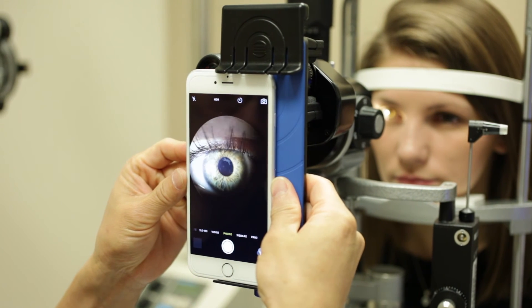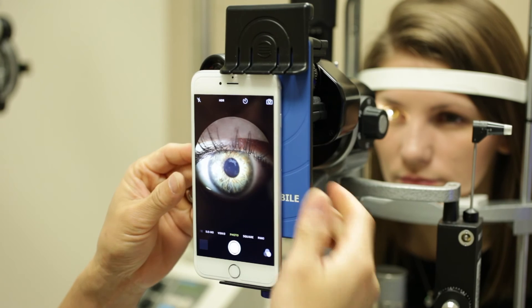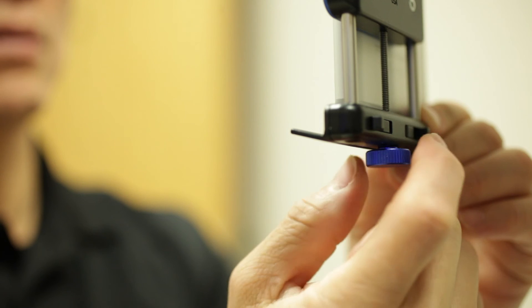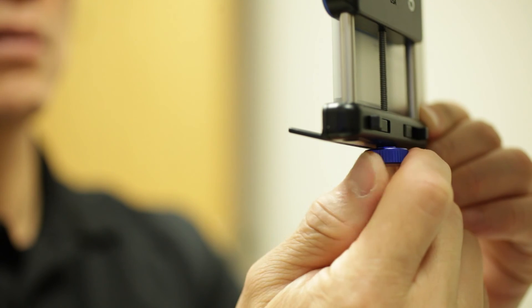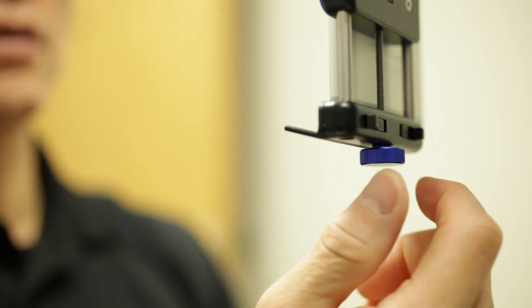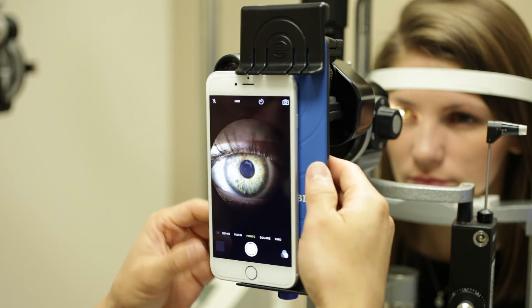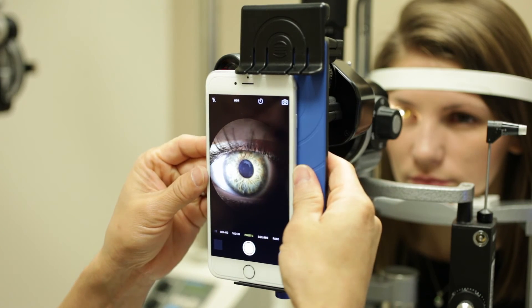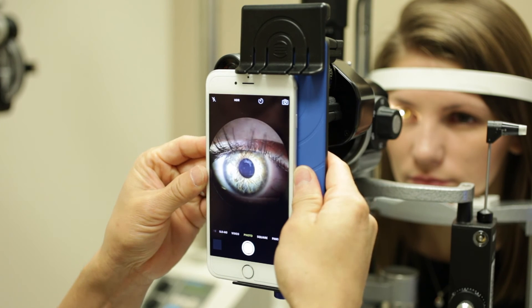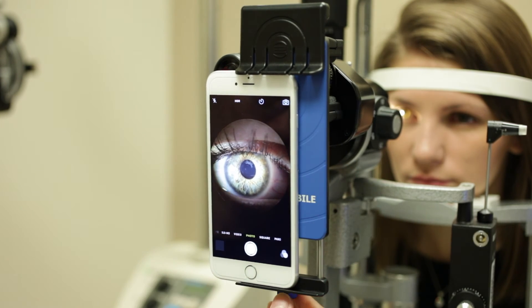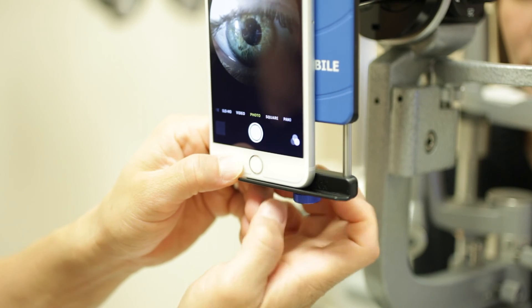To center the image, slide the phone left or right or use the control knob to move it up or down. Make sure to support the phone dock with your other hand.